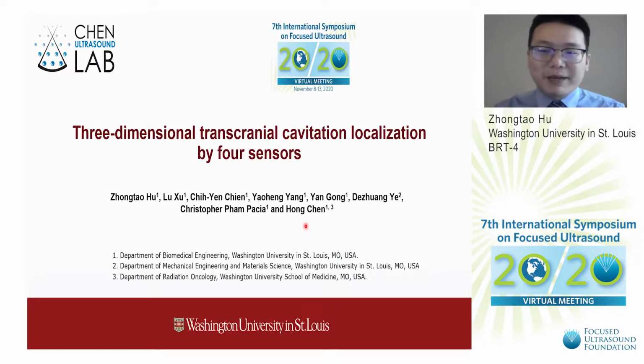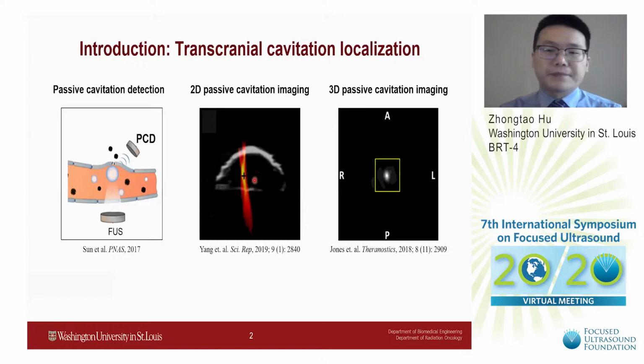The title of my presentation is Three-Dimensional Transcranial Cavitation Localization by Four Sensors. Transcranial cavitation monitoring is critical to cavitation-mediated therapeutic techniques in the brain. Existing passive cavitation detection techniques only require a single sensor, but it can't tell where the cavitation occurs.